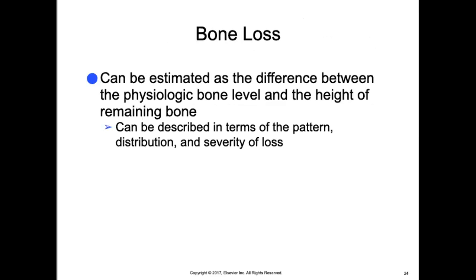Bone loss can be estimated as a difference between the physiologic bone level and the height of the remaining bone. This can be described in terms of the pattern, the distribution, and the severity of loss. An image allows the dental professional to view the amount of bone remaining rather than the amount of bone loss.